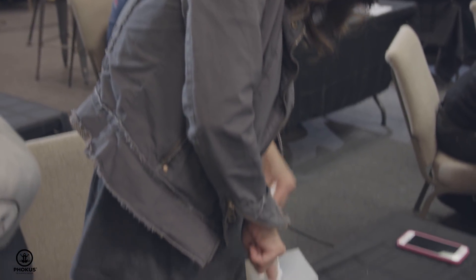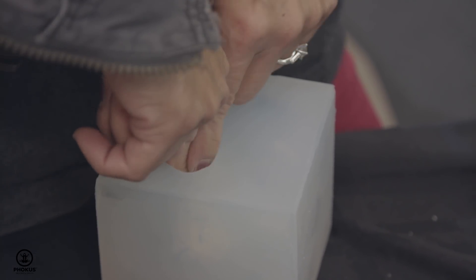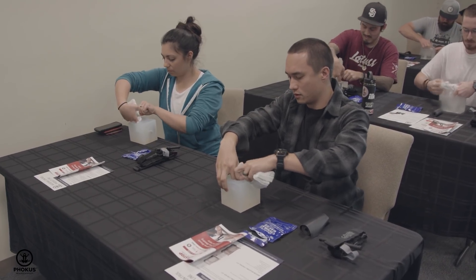One of the really cool benefits of the cube is you're able to actually see your progress when you're packing it. It's not necessarily straight down — you have to find the nooks and crannies of the wound. You can't just go straight down and assume that that's going to cover it.